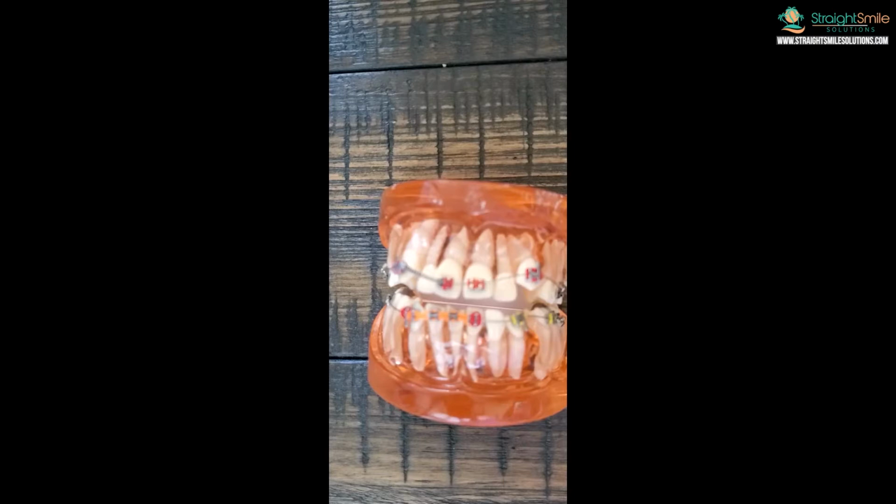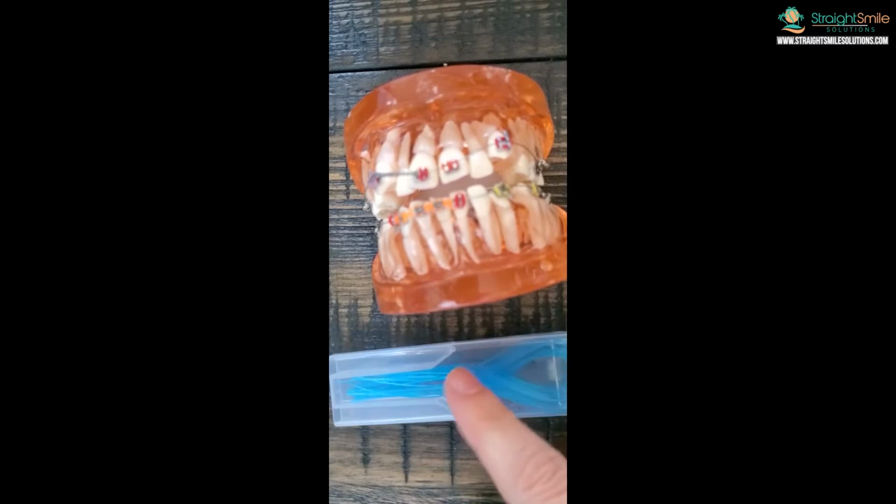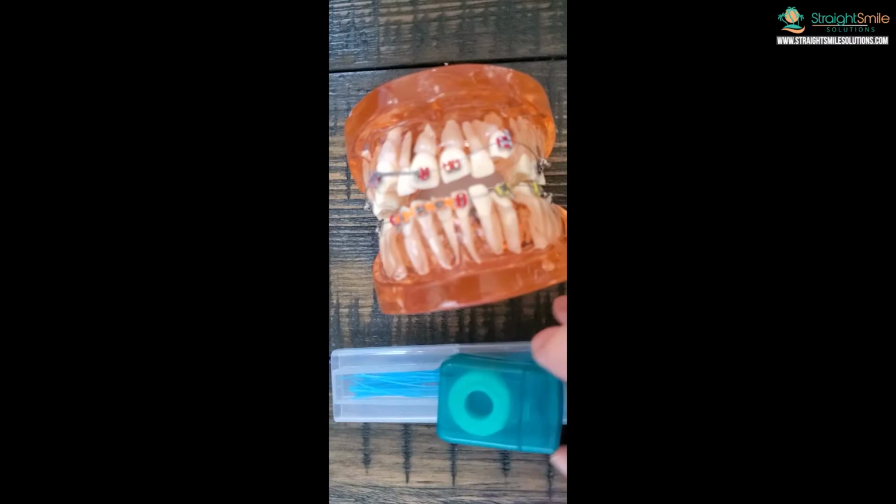Those are floss threaders. They go with floss. You can buy these all together. Personally, I think these are uncomfortable. These plastic ones, even though they are reusable, they're cheaper. I don't like them. When I had braces, I never used them. I like one that's called Super Floss, like Superman, but Super Floss, and it's all in one. It's so comfy and easy to use, but this is the cheap version, just to let you know. Okay, so we got that.